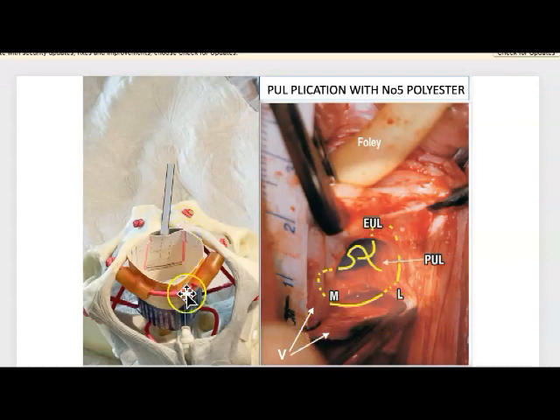What we do with the surgery is make two incisions here, four centimeters, and open it out. Then with forceps we put sutures up here to the mid urethra, laterally to the lateral part, up behind the symphysis and down. The idea is not to tie it too tightly — just loose enough so that it doesn't come down.